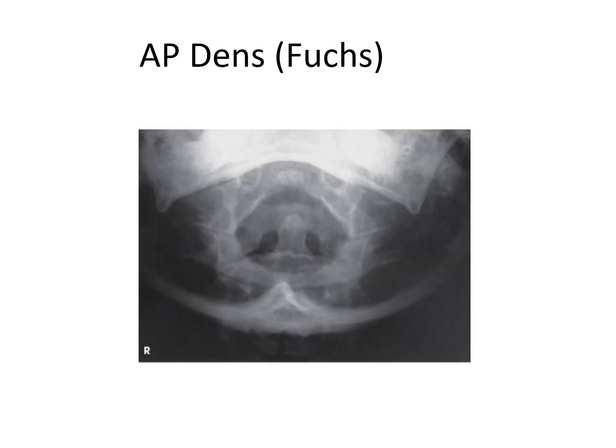And this is how it looks if you do it right. On the bottom you see what looks like a single mountain peak on a curved surface. That's the occipital bone, the base of the patient's skull. At the top, you see a canopy that's brighter white. That's the patient's mandible. The dark circle in the center is the foramen magnum. And then the little bone that looks like a tooth, that is the dens of C2.